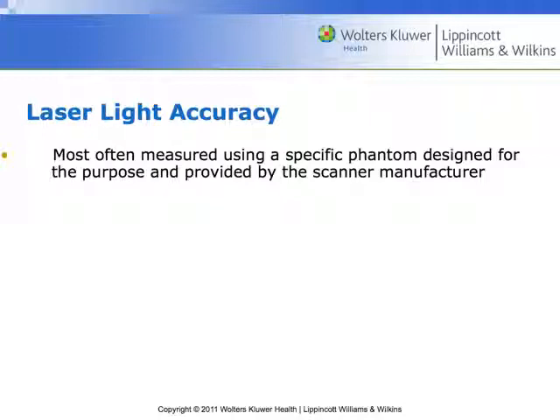Laser light accuracy. I'm going to turn on the lasers and line them up to the phantom and see if they converge at isocenter. Because a lot of times what happens is eventually the lasers go a little bit out of whack. And now I'm not truly being able to zero the patient to that isocenter.